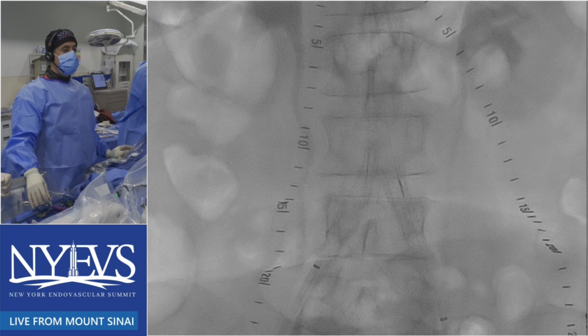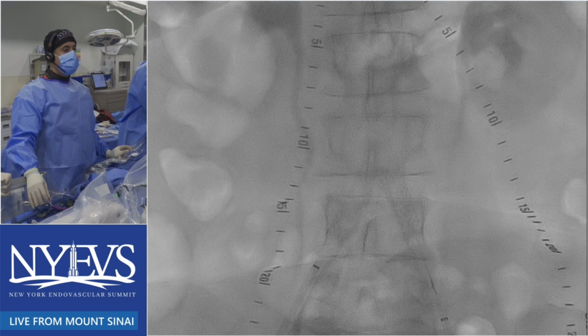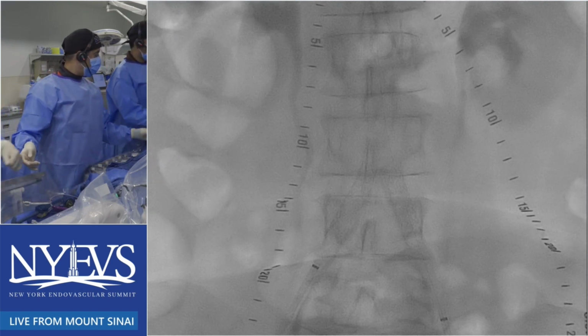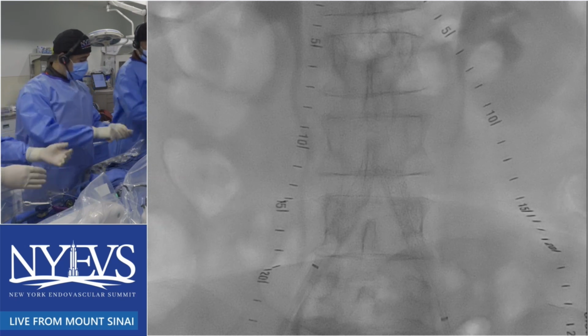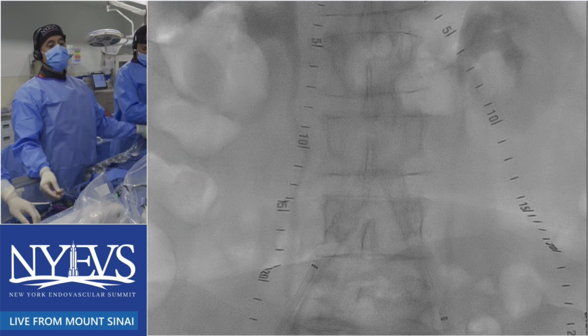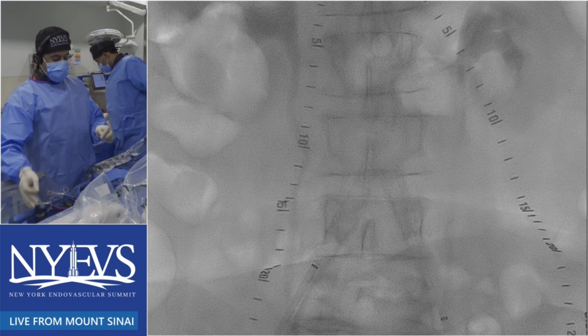I just had a question about measuring pressures. Now, I think we're measuring pressures as a surrogate of flow, but it can be falsified depending on what your resistance is distally. And that's why you have normal ABIs, even normal resting ABIs, with aortoiliac disease. So how credible is that to measure your adequacy of treatment?